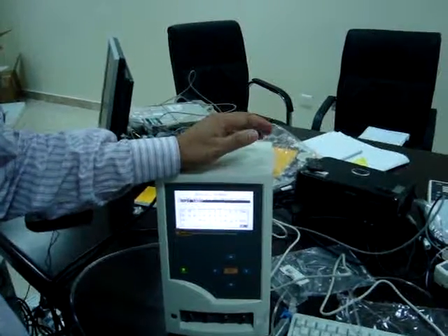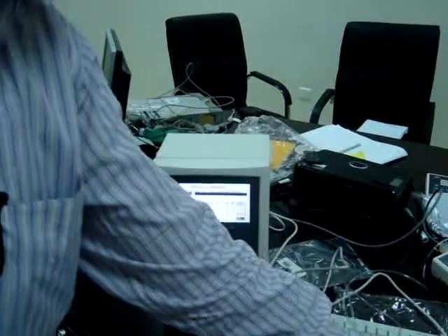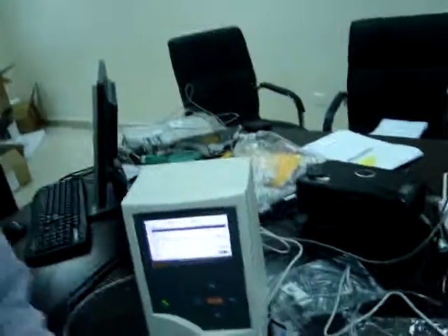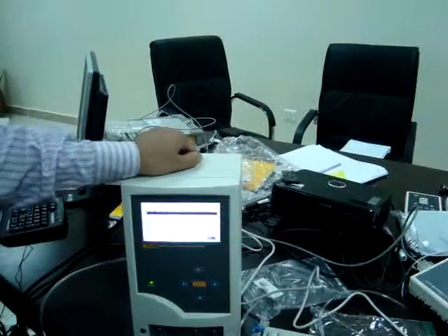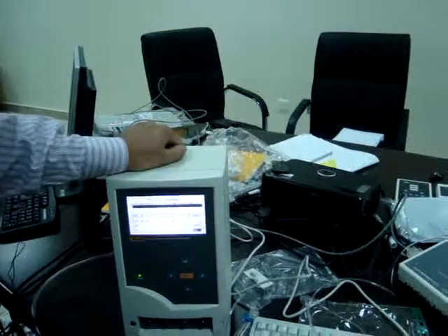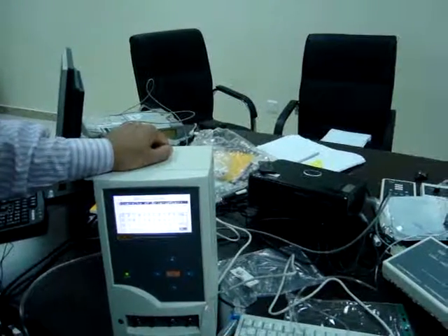How could I add method? No, not this one. Other than final. Control Z. No. This is not a computer. Just escape. If you want to go to the previous screen, escape.